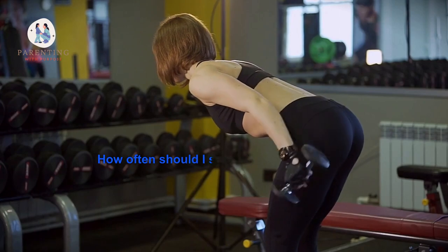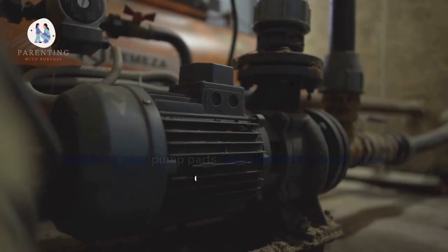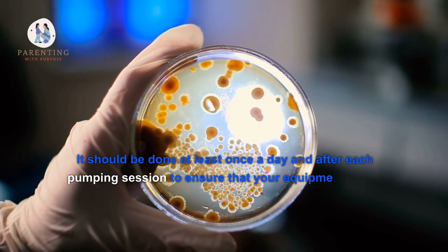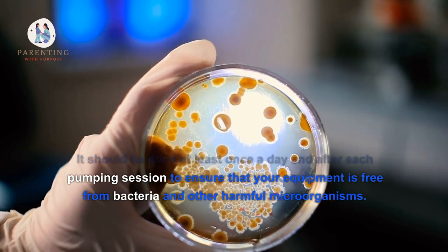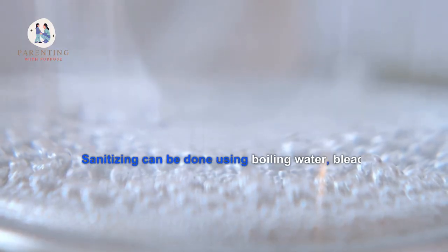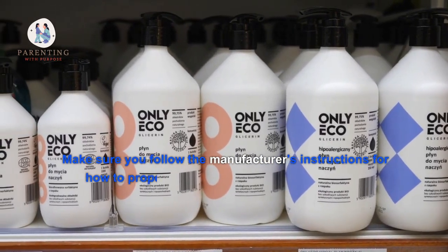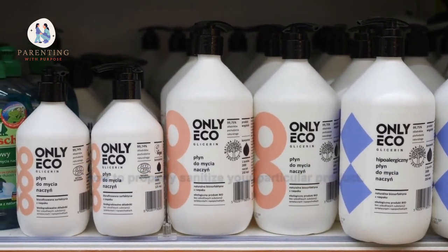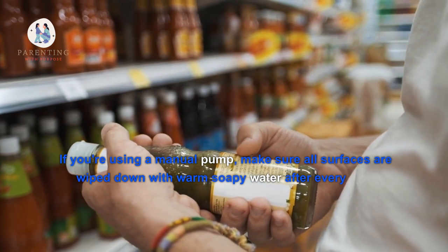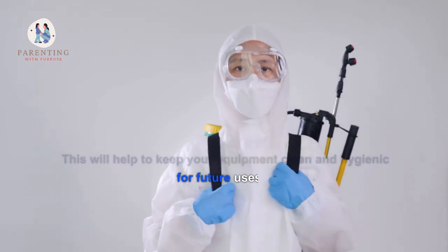2. How often should I sanitize my pump parts? Sanitizing your pump parts is an important part of proper cleaning. It should be done at least once a day and after each pumping session to ensure that your equipment is free from bacteria and other harmful microorganisms. Sanitizing can be done using boiling water, bleach solution, or the dishwasher. Make sure you follow the manufacturer's instructions for how to properly sanitize your particular product. If you're using a manual pump, make sure all surfaces are wiped down with warm soapy water after every use. This will help to keep your equipment clean and hygienic for future uses.